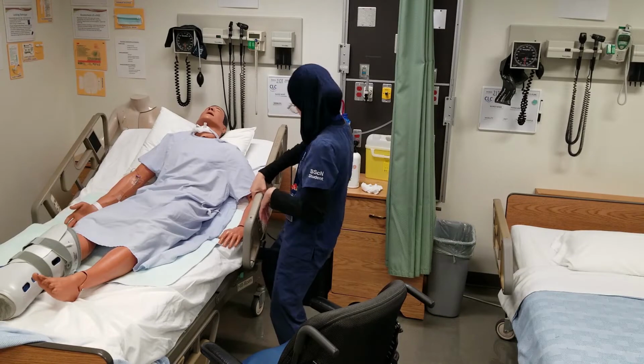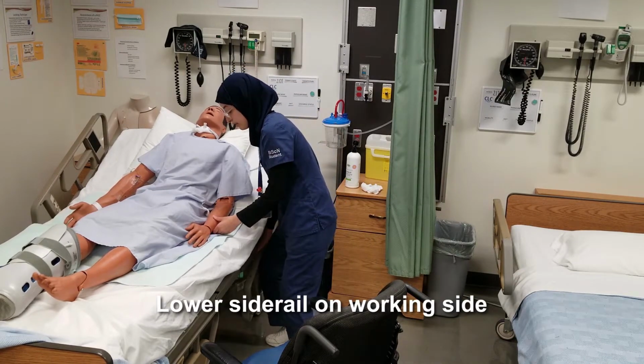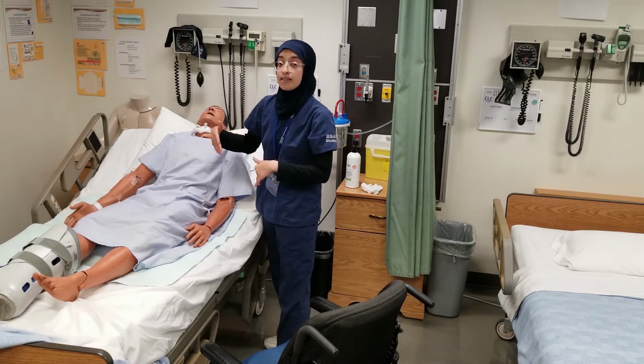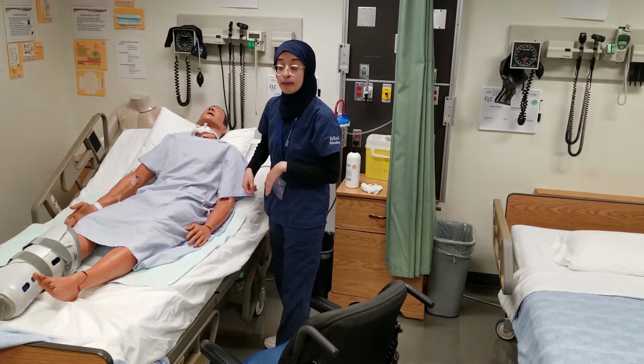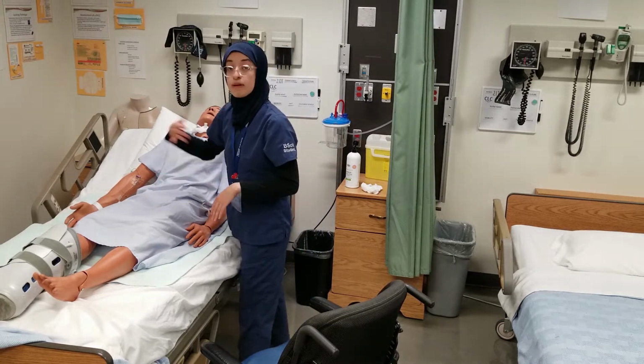Right, then I'm going to move the arm side rail out of the way. And now that I'm next to the patient, I'm acting as that side rail. So if I have to move for whatever reason or leave the room or leave the patient's side, I want to make sure that I'm putting that arm rail back up and I'm moving the bed to the lowest position for the patient's safety. So I'm going to go ahead and move the patient onto their side.